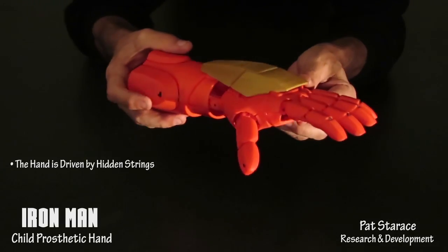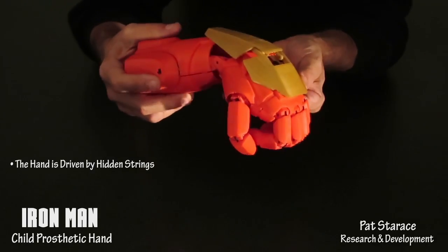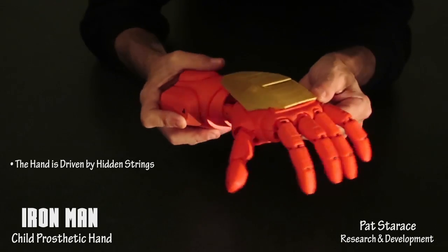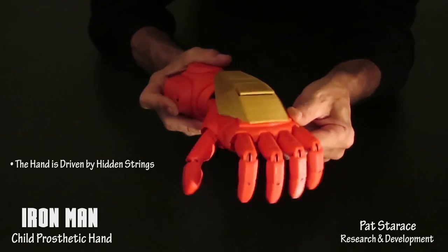The hand functions when the child bends his hand down — the fingers close. When the hand comes back up, the fingers open. Fingers closed. Fingers open.